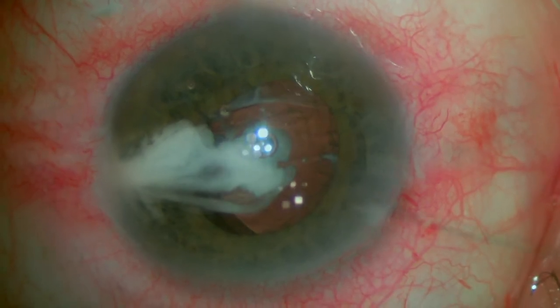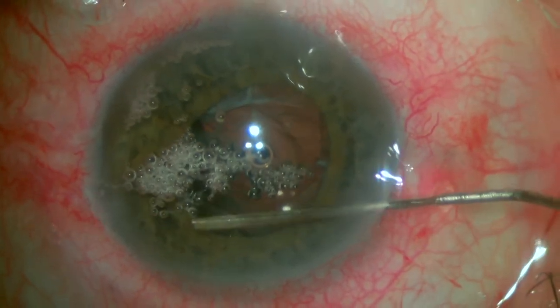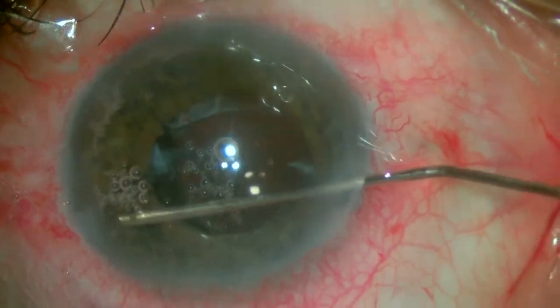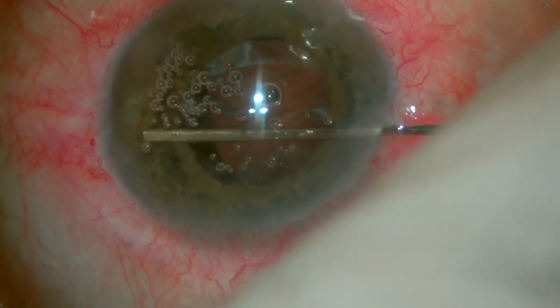One more time, a little bit of triamcinolone is injected and then irrigated with a cannula and some BSS. This is useful just to make sure and double check if there's any vitreous that might have gone to the AC during our previous maneuvers.